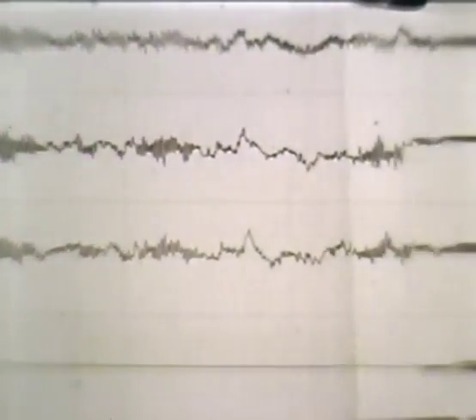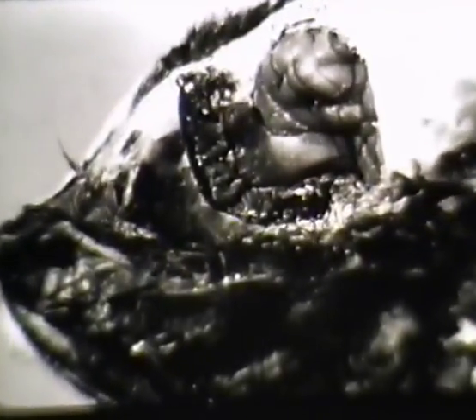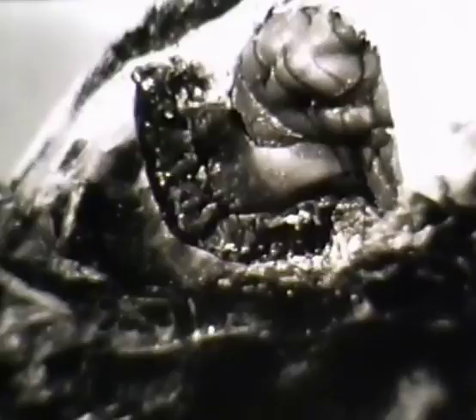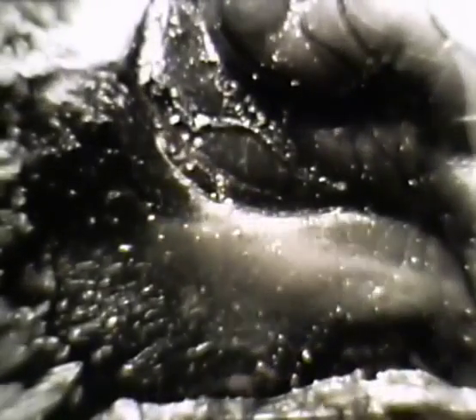The recording electrode arrays are placed under anesthesia. The skin and soft tissues are reflected, and the contents of the orbit are removed. The medial wall of the orbit is resected, and the dura covering the olfactory bulb and cortex is removed. The bulb measures approximately 1 centimeter from dorsal to ventral poles. The white area is the lateral olfactory tract on the cortex.